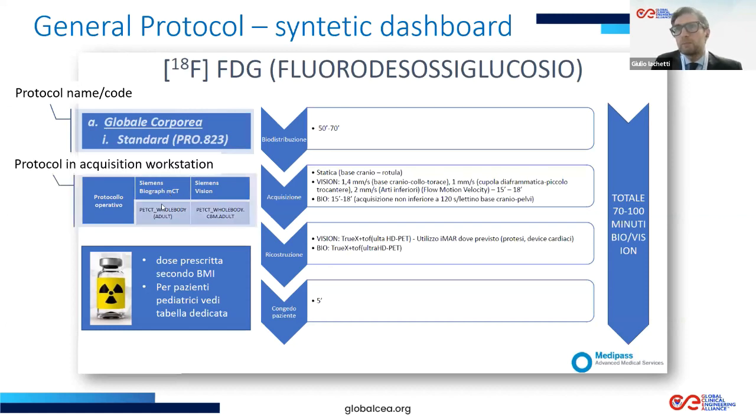It's important to have, in the acquisition workstation, the same protocol that is clarified for the technician, which is the protocol that is the basis of the diagnostics for the patient.